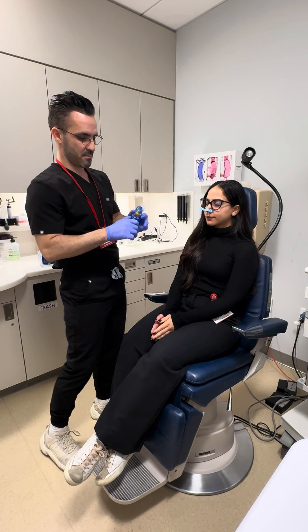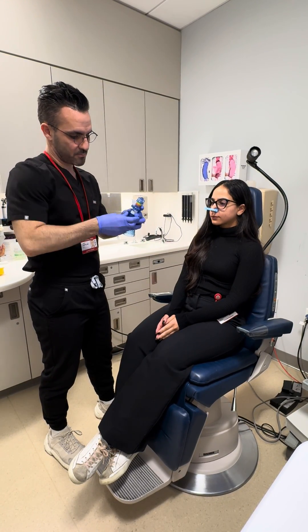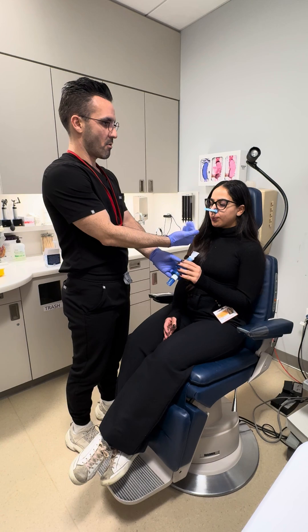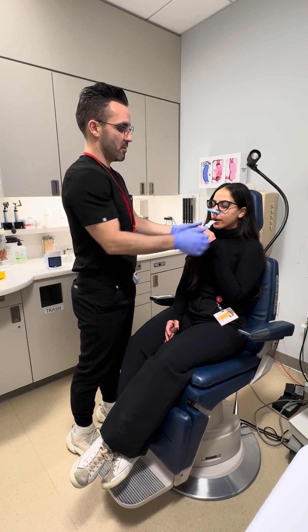Excellent, I'm gonna make this harder now. Let's move this up to around 60. Good, don't hold on to it. Blow out — go, go, go, go, go, go, go, go, go. Stop, bite and suck in. Good.